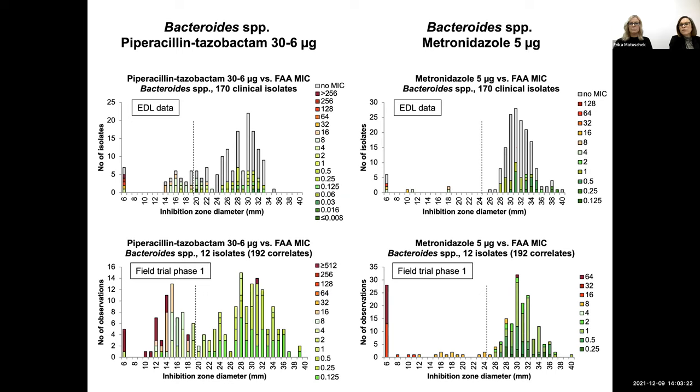Yeah, the question maybe relates to when you're actually performing the susceptibility testing procedure. And then it's just our standard recommendations that you should use your inoculum within 15 minutes of preparing it, streaking the plates within 15 minutes of preparing the inoculum suspension, and then putting the plates back into the anaerobic environment within 15 minutes. But then, of course, if you have incubated the strains that you're going to test, those should probably be kept in the anaerobic environment as long as possible before you perform the test. But when you perform the procedure, there is no problem having them out at room temperature. Glad you added that, Erica.